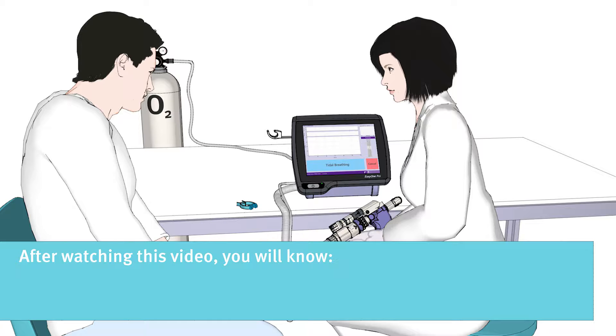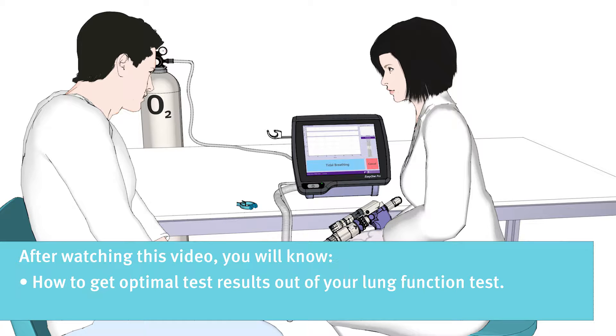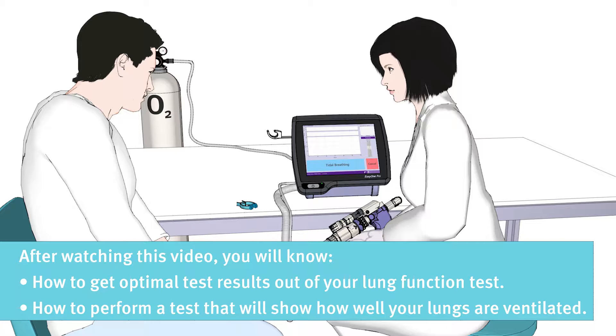After watching this video, you will know how to get optimal test results out of your lung function test — how to perform a test that will show how well your lungs are ventilated.